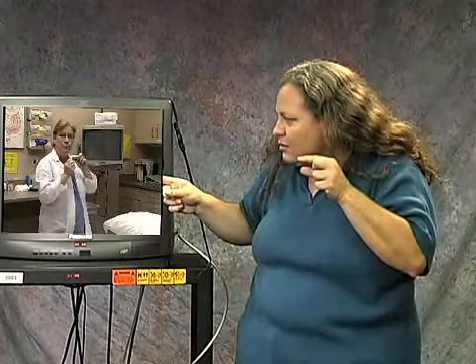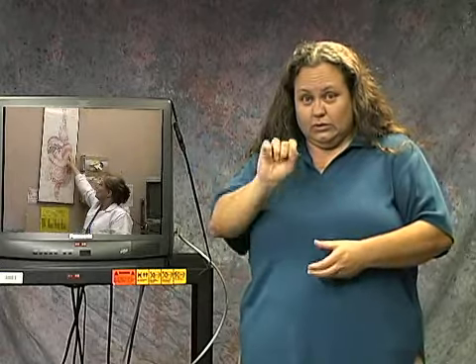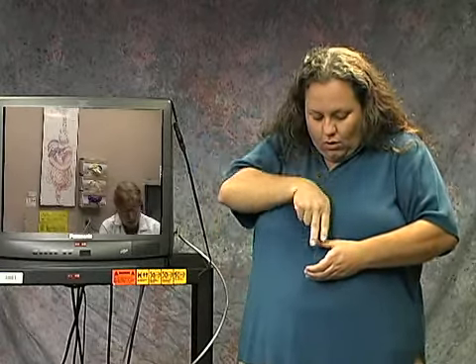The doctor is concentrating his efforts on what he is doing with you. He will have you insert a small bite block like this into your mouth, which you just gently bite with your teeth. He'll insert the scope across the back of your tongue, and he will insert it all the way down your esophagus and into your stomach. We'll look all around through your stomach with it.